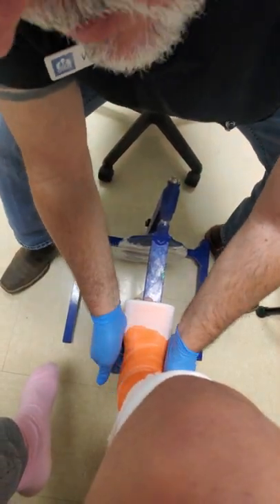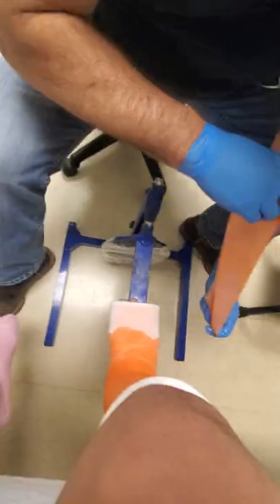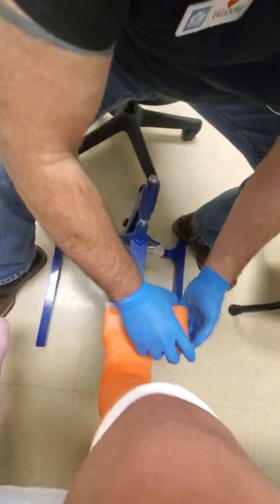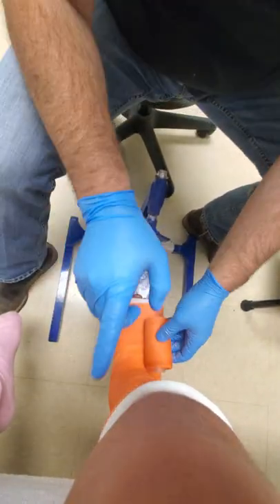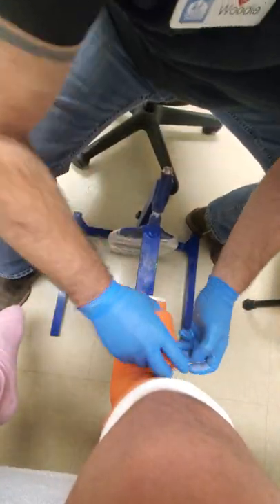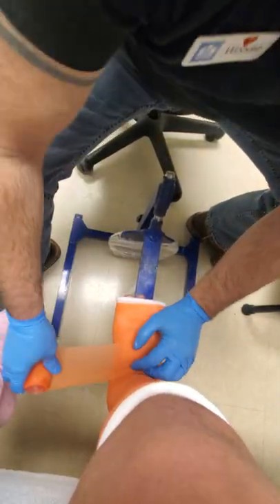We actually still have time to work with this. I'll go ahead and put the second two layers on and then show you how we shape it. I went ahead and put the extra layer to create the cuff on the top already, finishing up the bottom, and then we're going to switch the stand to the positioning plate — the molding plate.